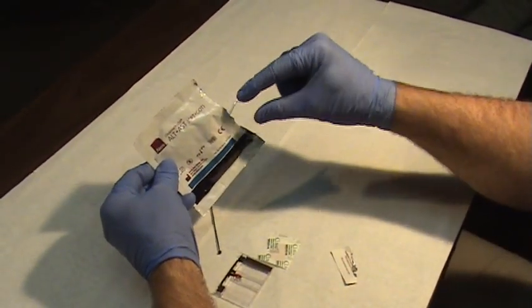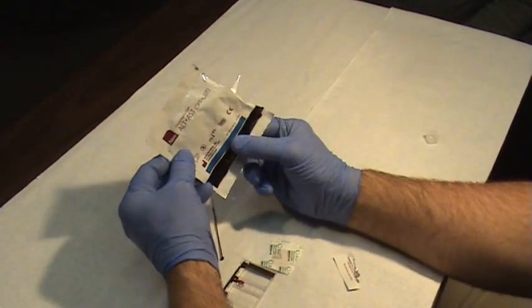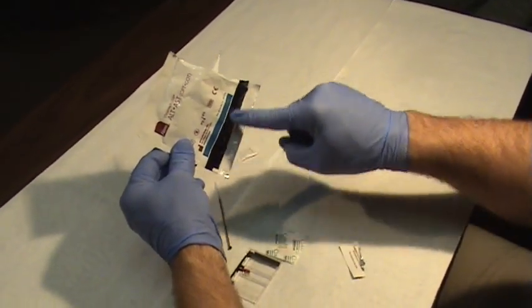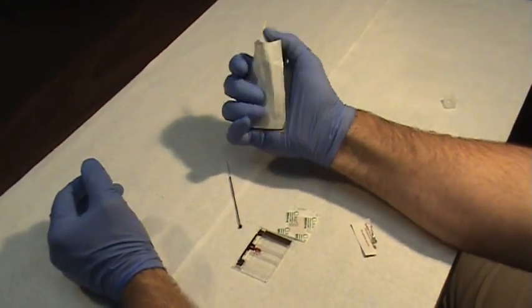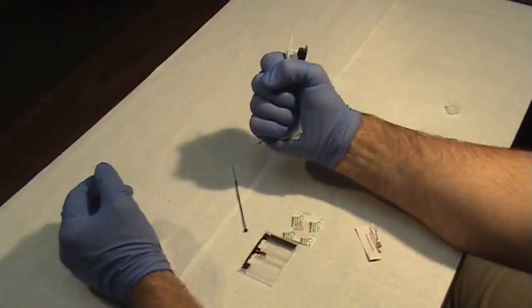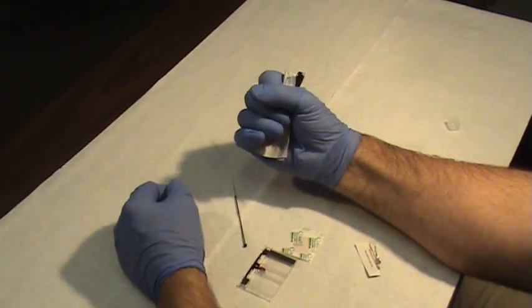Place it in there and if you remember to always place your lancet linear along the back line when you grab it and squeeze it like this, you will not risk puncturing your hand with the plunger.